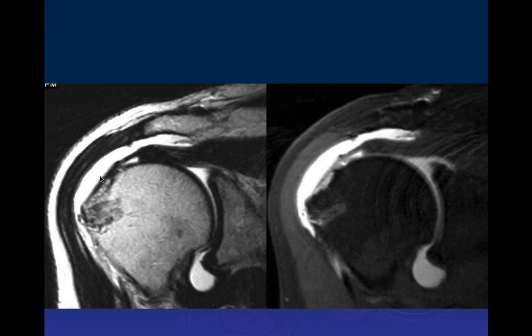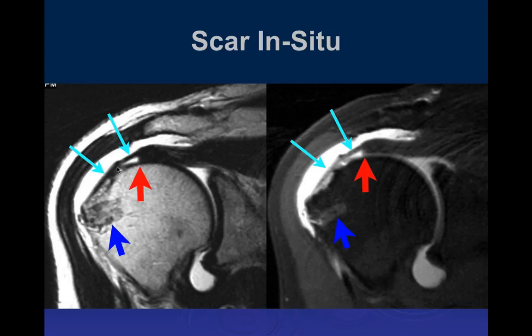So this scar in situ can actually be very dense. However, the material itself is pretty friable. It's not very strong. So this is really a complete tear from the surgical fixation site with proximal retraction. And this is just the scar in situ. And you can see contrast is going freely through the area of the tear into the subacromial subdeltoid bursa. Okay.